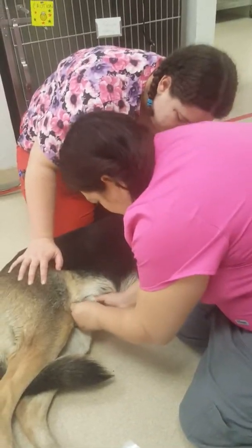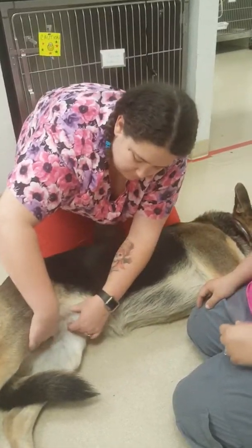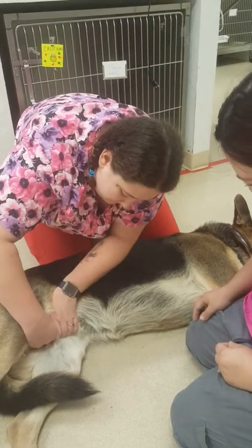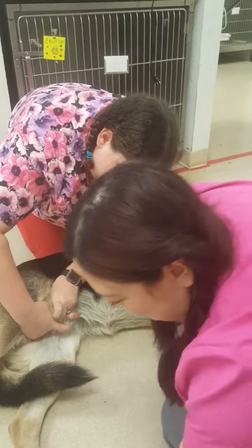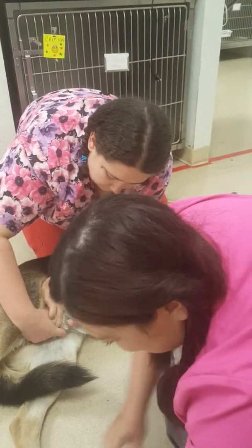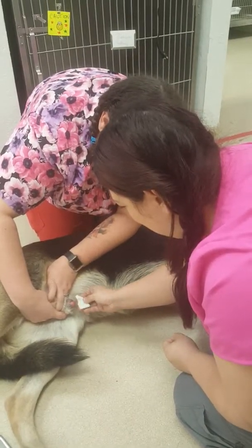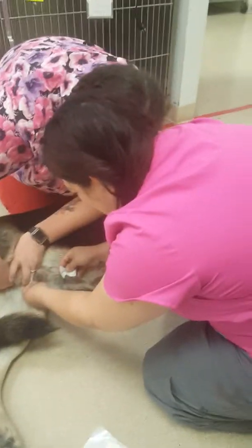We're going to go ahead and extrude the penis. Dave doesn't need anything from us. So when we retrieve the penis, one of the first things you want to do is clean it off — I like to use chlorhexidine.